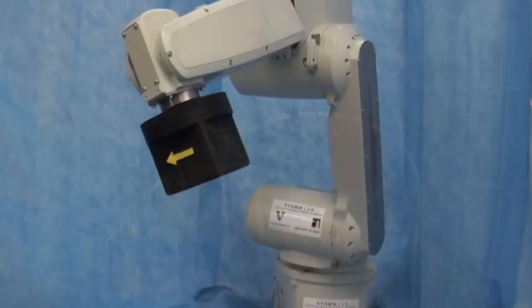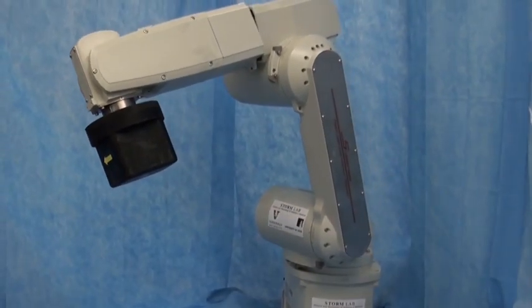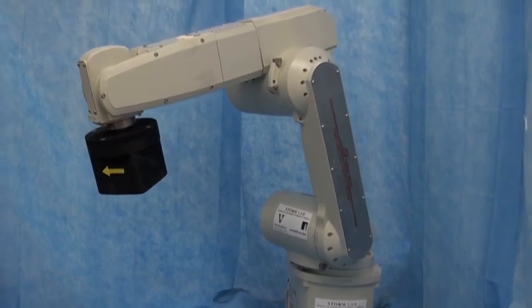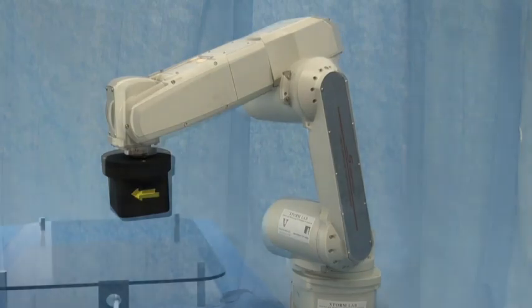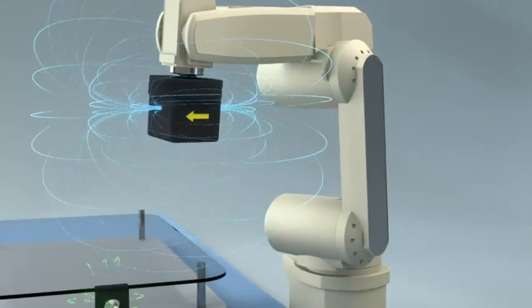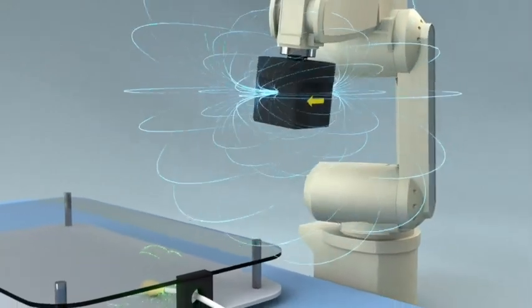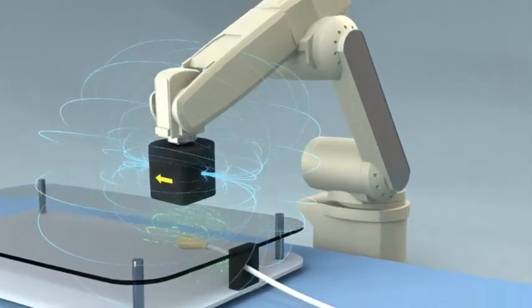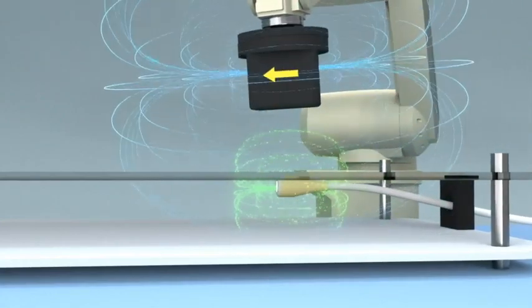The actuating magnet is manipulated in 6 degrees of freedom by a serial robotic arm. Knowledge of the residual flux density and geometry of the actuating permanent magnet as well as proprioceptive sensing in the head are utilized via a localization algorithm to obtain both the position and orientation or pose of the endoscope's tip.